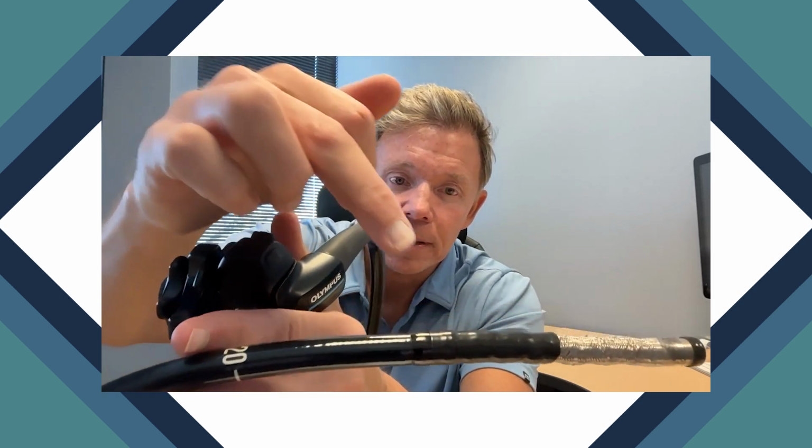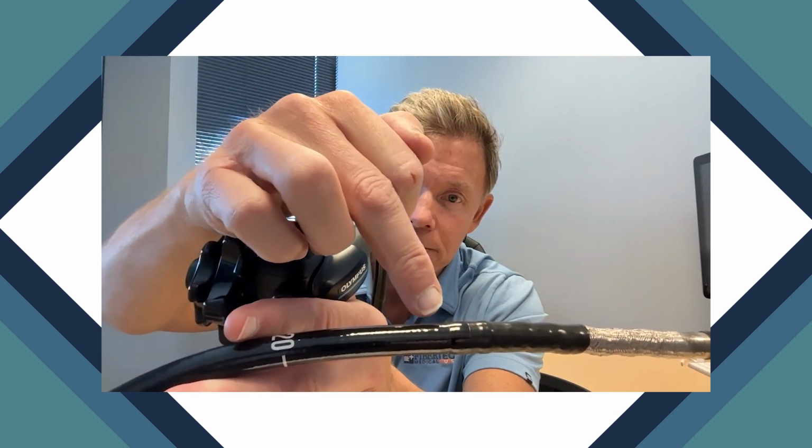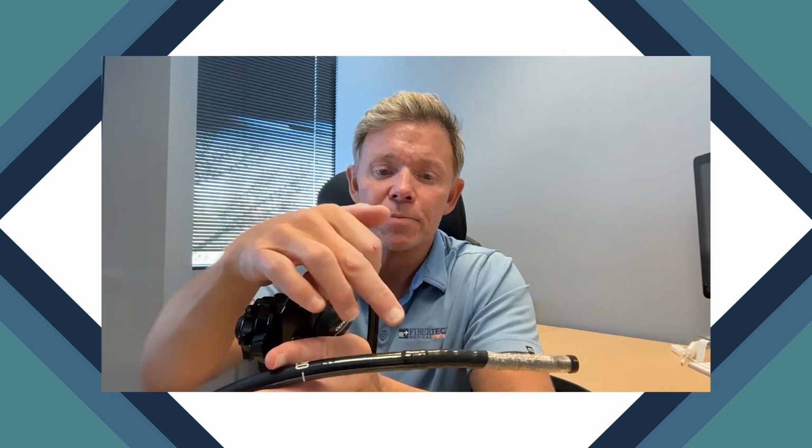Okay, when those adhesive rings are brand new, like this one, you can see it's nice, black and shiny, almost matches the look and texture of the insertion tube itself. What happens is both of these adhesive seals, over time, from the routine cleaning of the scope, the chemicals that the scope is subjected to during the cleaning process, and the manipulation of the tube and the distal tip, those adhesives will break down.